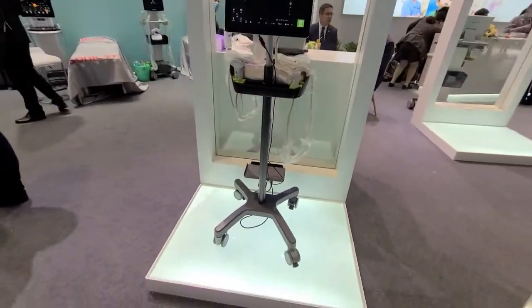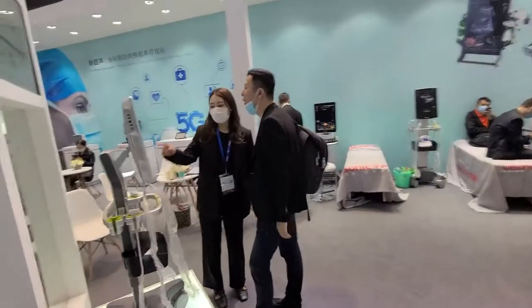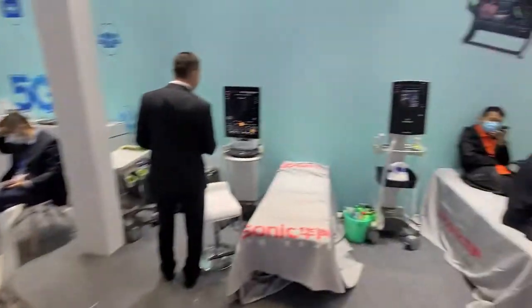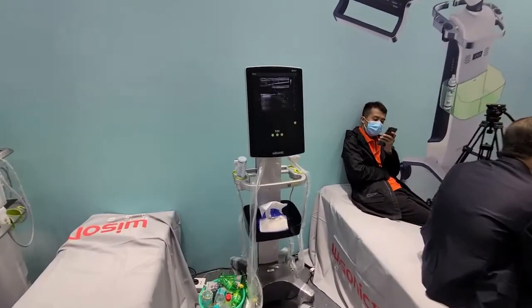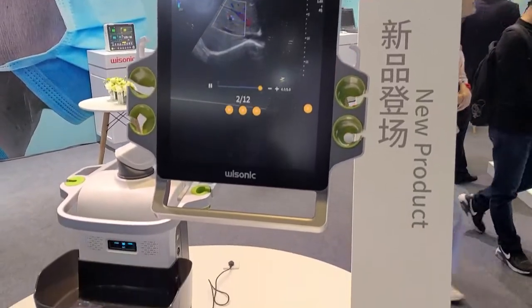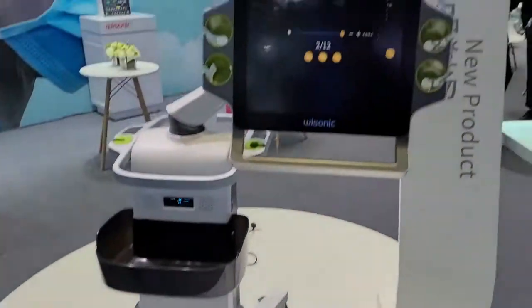Interestingly, the company found a lot of demand in 2020 from international players who procure their equipment, which is very simple. It only consists of a monitor and transducer probes. So this equipment was procured by fever clinics globally due to its very simple design. Monitor and transducer probes are easy to clean as opposed to computer and keyboard based standard ultrasound equipment.